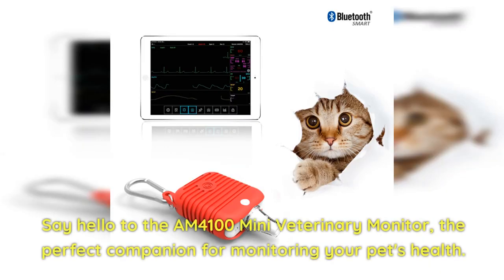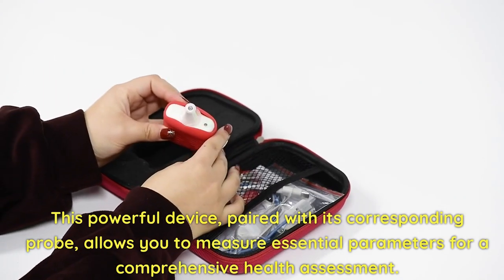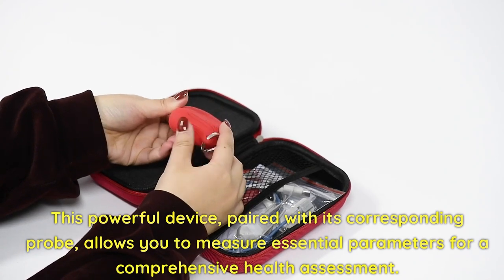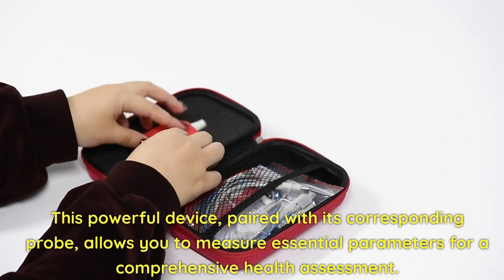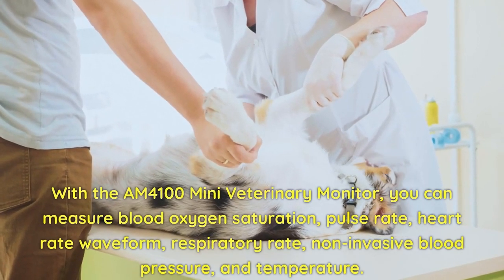Say hello to the AM4100 Mini Veterinary Monitor — the perfect companion for monitoring your pet's health. This powerful device, paired with its corresponding probe, allows you to measure essential parameters for a comprehensive health assessment.